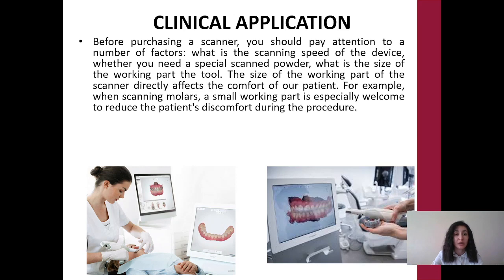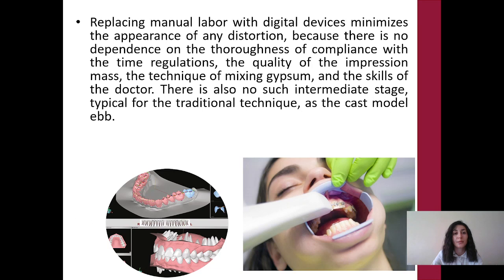Clinical application. Before purchasing a scanner, you should pay attention to a number of factors. What is the scanning speed of the device? Whether you need a special scanning powder? What is the size of the working part of the tool? The size of the working part of the scanner directly affects the comfort of our patient. For example, when scanning molars, a small working part is especially welcome to reduce the patient's discomfort during the procedure.